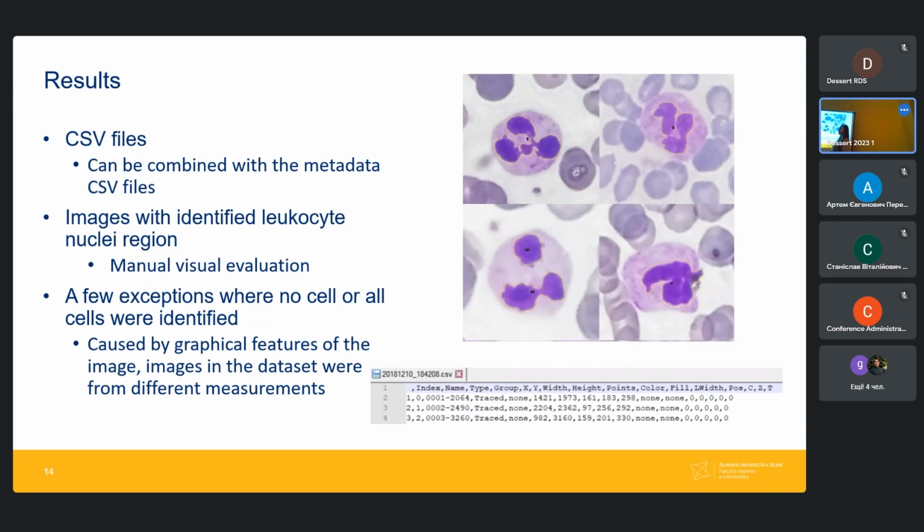So one expert-marked region, and the system detects two. The evaluation algorithm works that way: it takes the region and examines if the region is a subset of this bigger region. So if there were 3 or 5 and they were all a subset of the bigger region, they would be just evaluated as one.